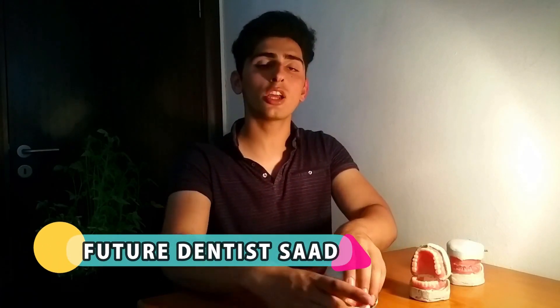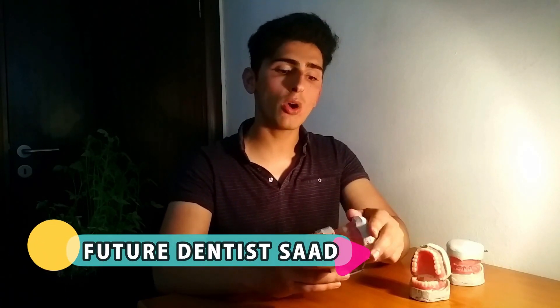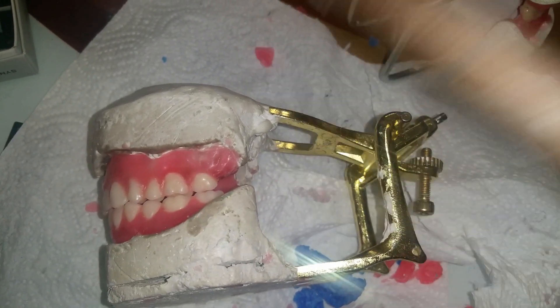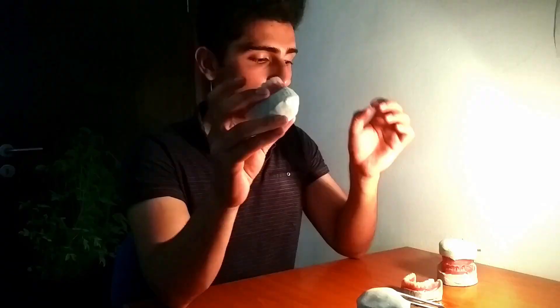In our exams we did not need to flask our models, so from now on I'll be showing a different model that I had used in class. When it comes to flasking, we begin the whole process by breaking the articulator — we take the articulator off so you are left with only a maxillary part and a mandibular part.